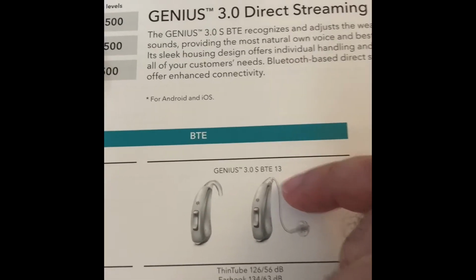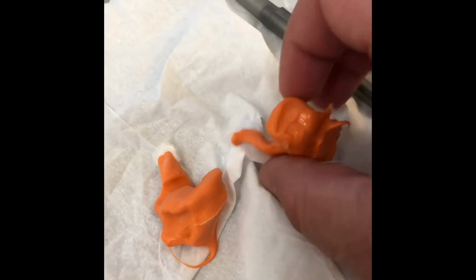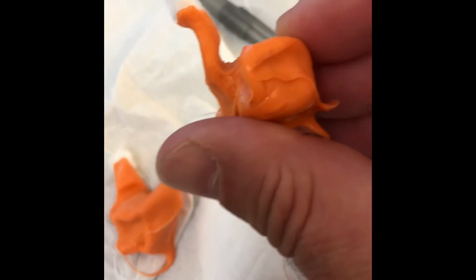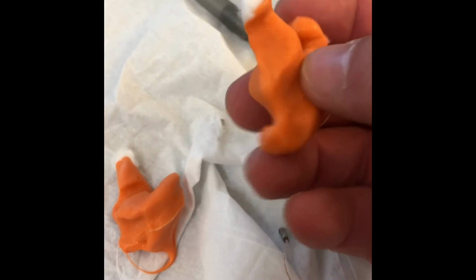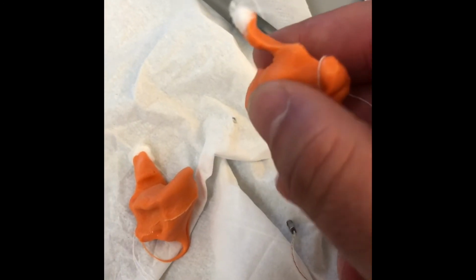This is one reason why you would choose a different style other than a RIC. Keep that in mind. You need to look at their ear canals as part of how you fit them behind their ears, to see how much space is down there. She wouldn't even fit in a ready-fit.